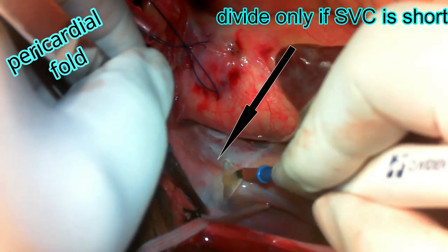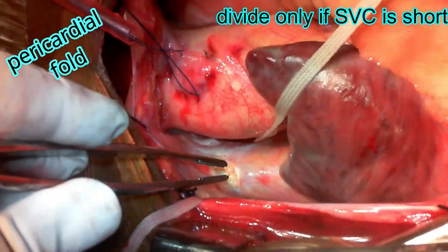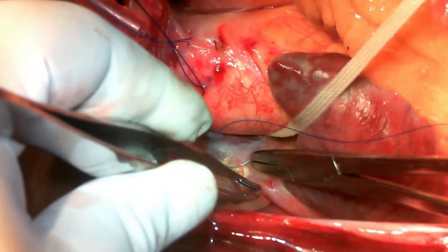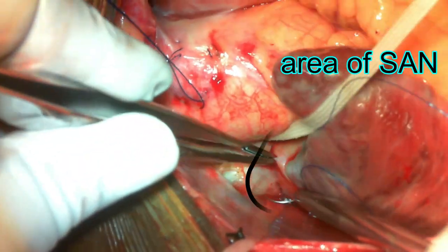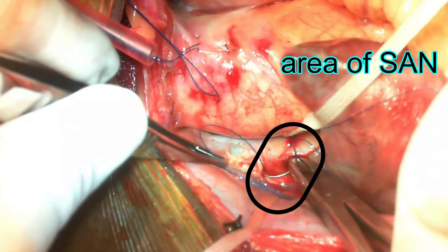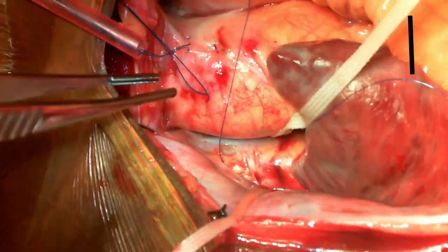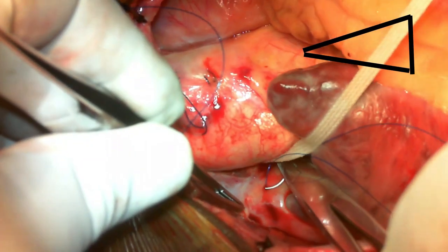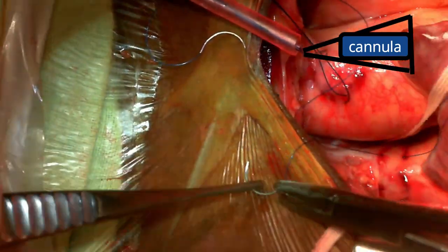Depending on the size of the venous cannula you need to take the purse string. Opening this pericardial fold is not a good idea as it may lead to right-sided pleural effusion postoperatively. Avoiding the area of the sinoatrial node, take a long purse string to accommodate the chosen venous cannula. This is a dilated heart in a volume overload state, so you need a bigger SVC cannula. The purse string is taken in a triangular fashion — one limb towards the assistant side, one towards the surgeon side, and the tip towards the pericardial fold.